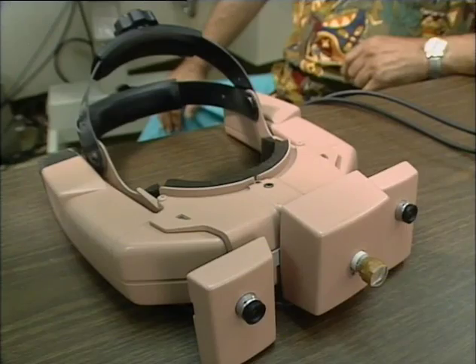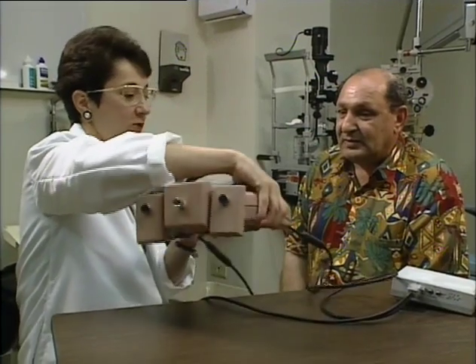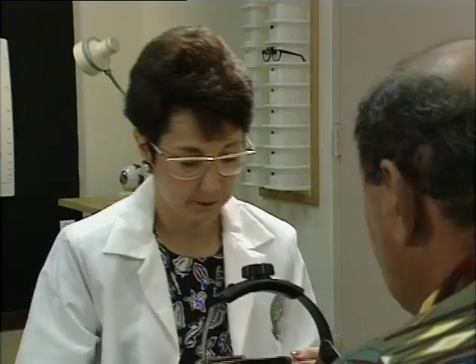Simple low-vision aids like these have been around for years. But just around the corner, there are big changes. We call it Elvis. It's a nickname. This is a prototype system that will use advanced computer and video technology to help people like Leonard. And it has a number of attributes, but the first one that we're going to evaluate is just the magnification that it can provide at distance.